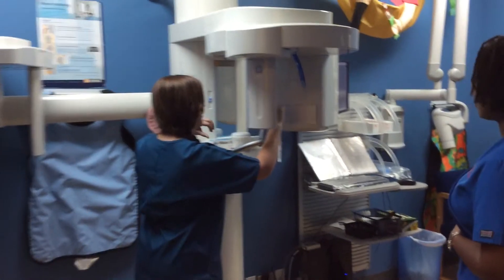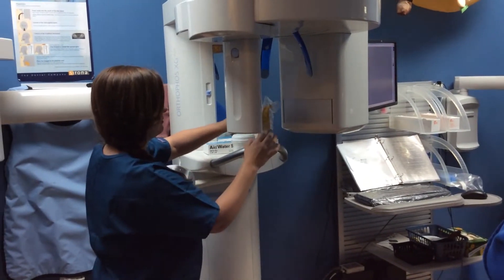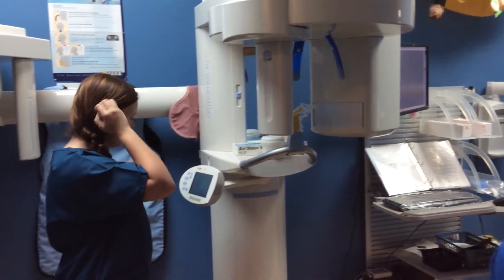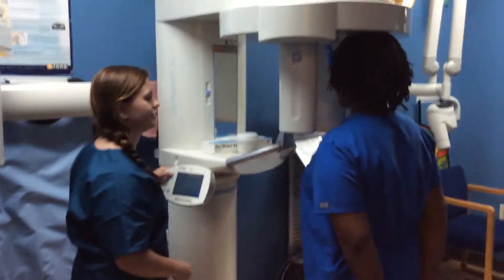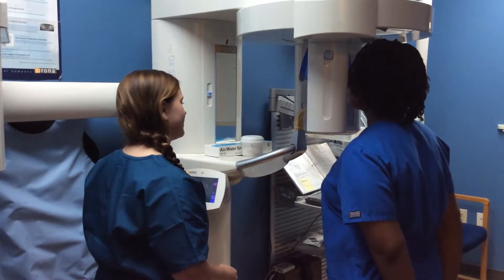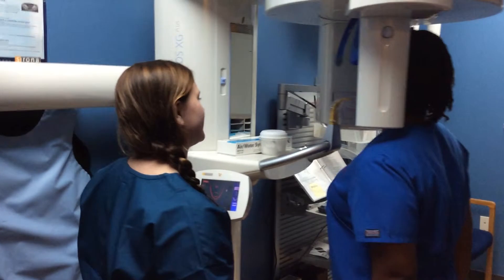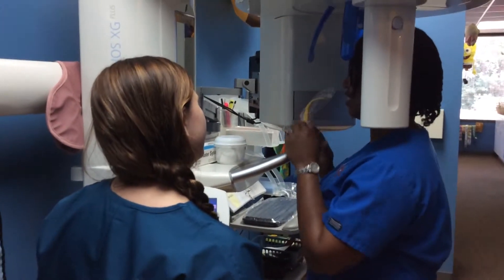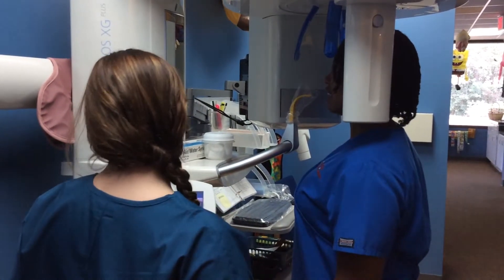We're going to put this on there for Ms. Robin so she doesn't get any germs — on the actual white block. Ms. Robin, if you would step on up. We're going to raise it a bit — she is shorter than I am. I think I made it a little too tall, but it's okay, you're doing good.